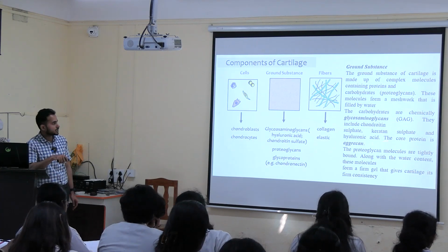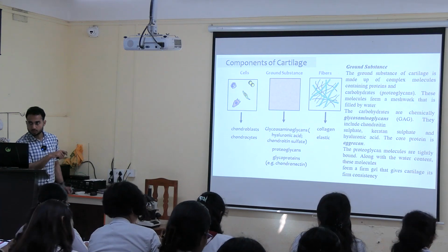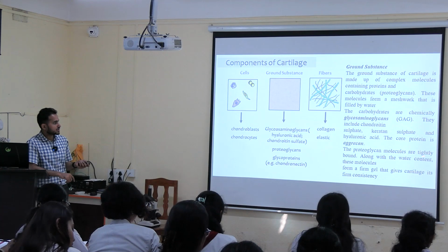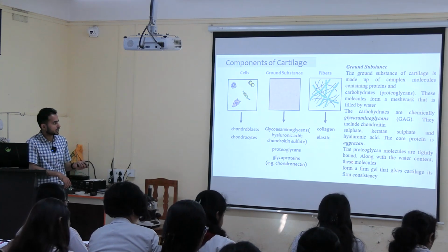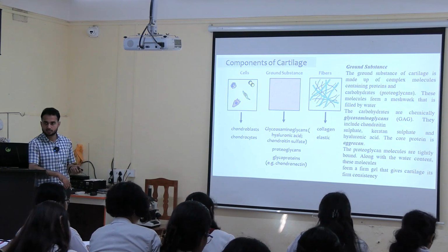The core protein is aggrecan. All those things you will study in biochemistry, don't worry. Now the proteoglycan molecules are tightly bound. Along with the water content of these molecules, the firm gel-like consistency is present.